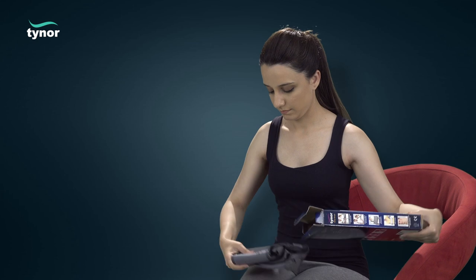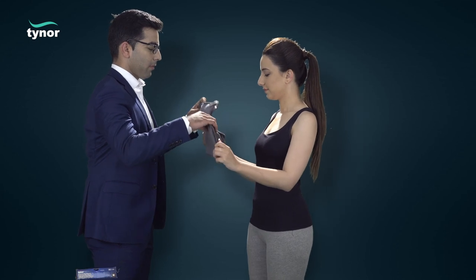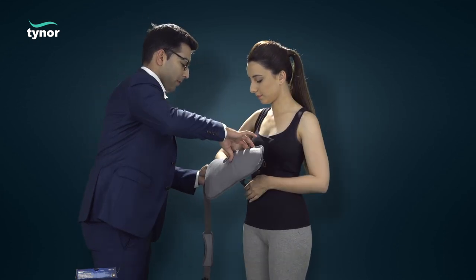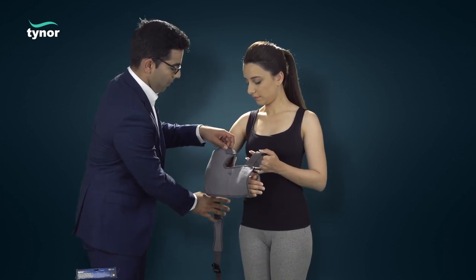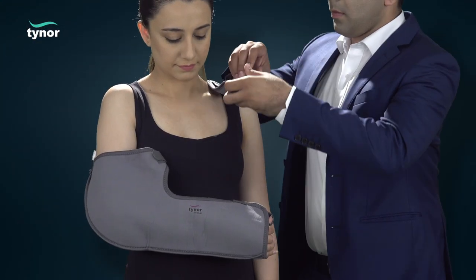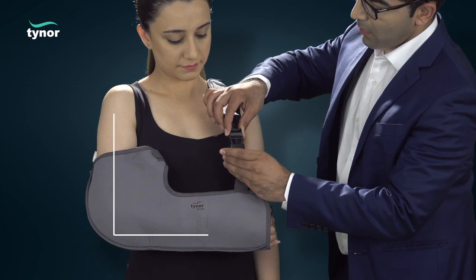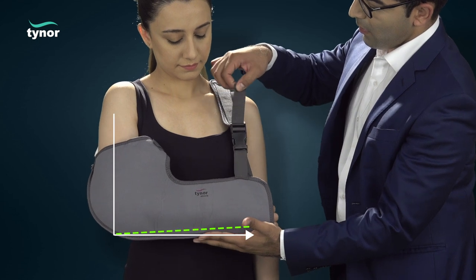Place the injured arm in the pouch. The sling is crossed over the shoulder, passed through the buckle, and enclosed at a comfortable position. The length of the sling should ensure that the arm remains in a flexed, slight acute angle position.